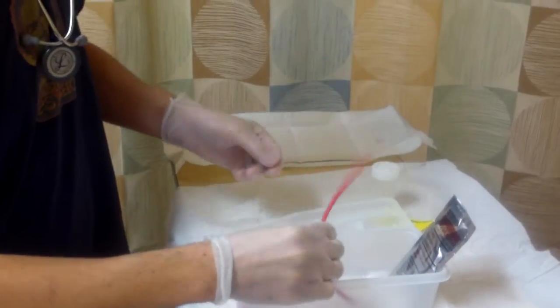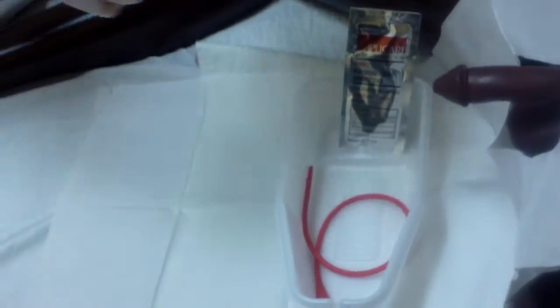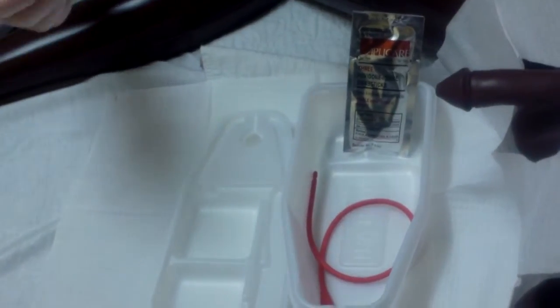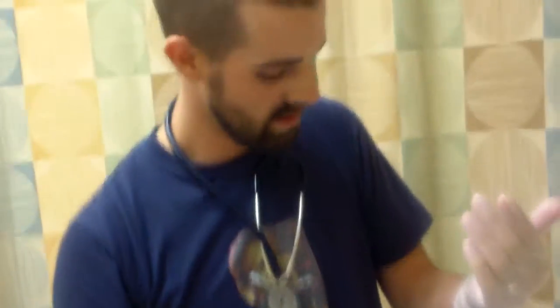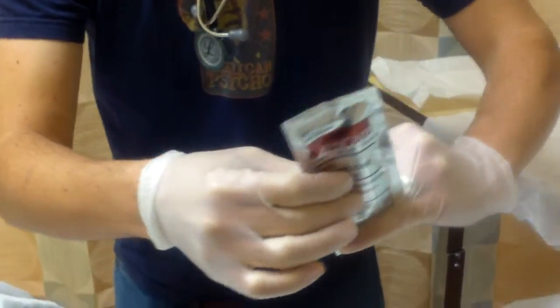I'm then going to take my catheter. I'm going to move my tray so it's closer to me. I would also bring a garbage can. Moving that right like that, and then having my lubricant tray. So now I need to have a clean hand and a sterile hand. So then what I would do is I would take my iodine sticks, place them down there like that. Be careful not to use the edge there because it might cause him pain.